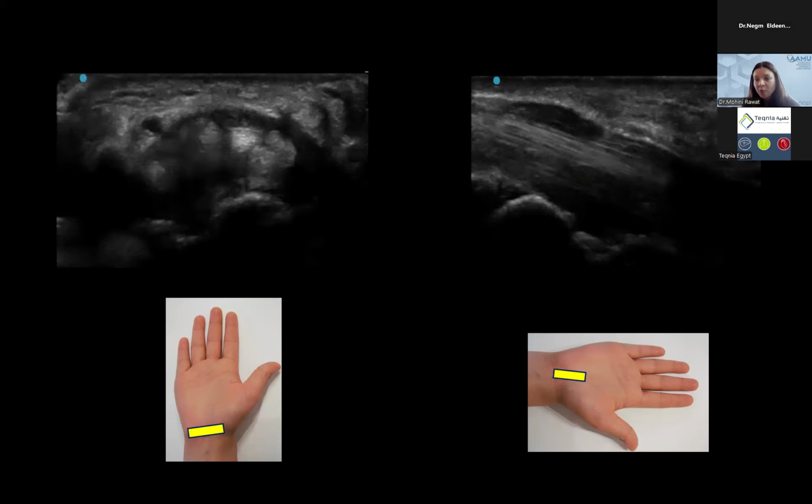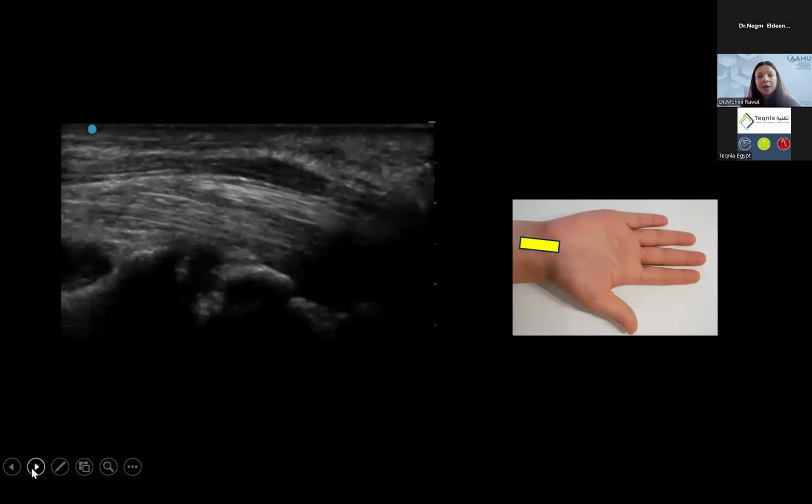There's a direct blunt trauma over that nerve, and that process of pressing with the volar aspect of the wrist can irritate the nerve and also affect the nerve fibers there. So here is this focal area where you can see the increased hypoechoic signal, but the rest of the nerve looks normal. So it's more localized to that area, some kind of micro injury to the microvessels there.